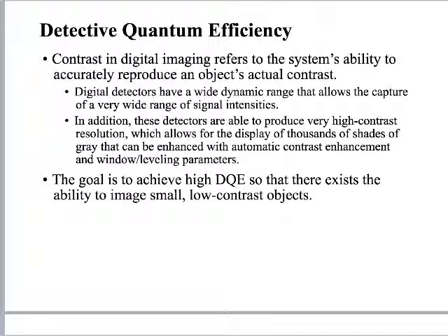What we're saying is, for digital systems, we cannot make the spatial resolution any better. That high contrast resolution, that spatial resolution, how tiny the TFTs are, how small the PSPs are, we can't make them any smaller. We cannot engineer electronic parts any smaller than what we've got. They're already smaller than what the human eye can perceive, so who cares, right? We cannot improve on spatial resolution. We just said forget about spatial resolution. So what can we improve on? Where can we make better systems?